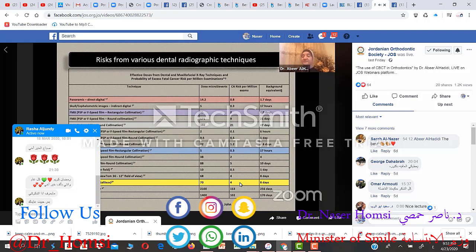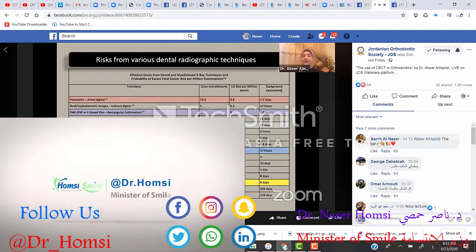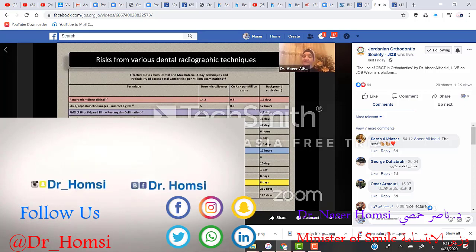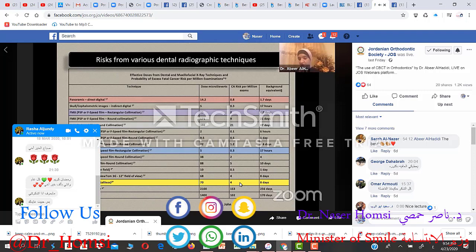One way of looking at those is background radiation. Just by living on the surface of the earth, in the days when we used to travel from country to country, the fact that the soil contains radioactive material, and some food that we eat has some radioactive material, we receive radiation just by being alive. So in publications, when they talk about radiation dose, sometimes they try to equate how much radiation dose a modality has in comparison to one day of natural exposure. For a typical cone beam CT that involves the maxilla and the mandible, that's almost equal to 8 days of background radiation. And in microsieverts, if we want to get a bit more technical, that's between 70 and 100 microsieverts. But if we want to compare that to how many days, or how much radiation dose, a CT that involves the same structures, the maxilla and the mandible, would have, you're talking about multiple folds.